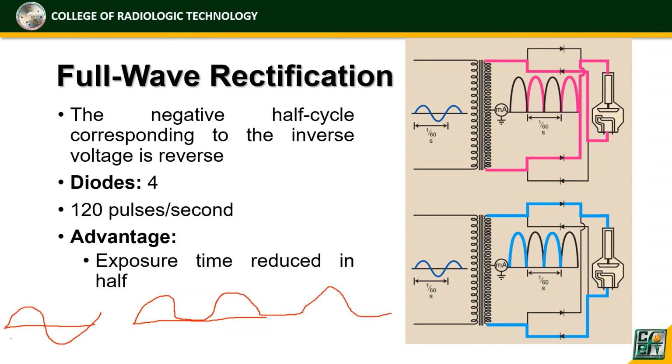Then full wave rectification. Ganyan ang full wave rectification.